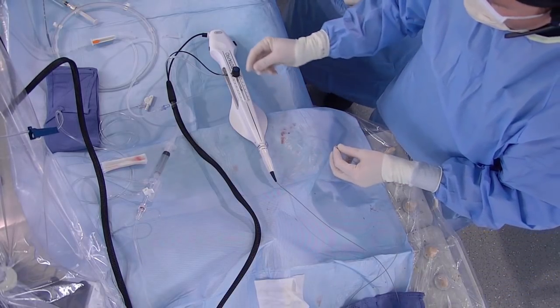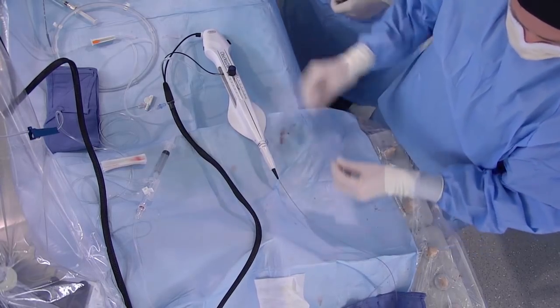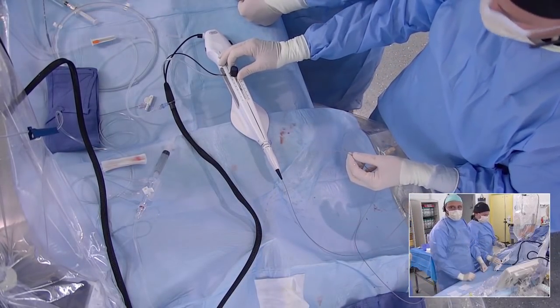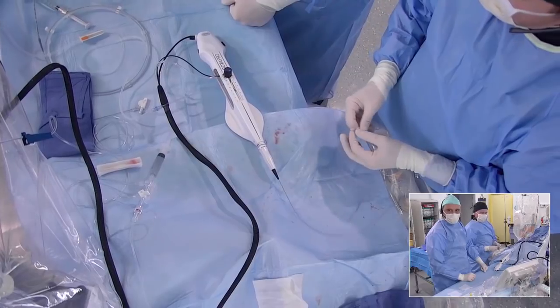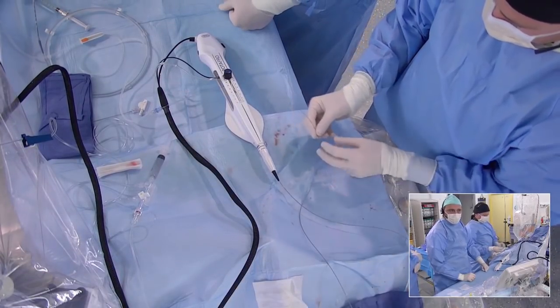And so we still have an air cylinder. It's over there on the cart. Perhaps if we move the camera towards the console, you will see the air cylinder. And all the previous cables are now wrapped up in a single cable to the new console. So that's very neat.